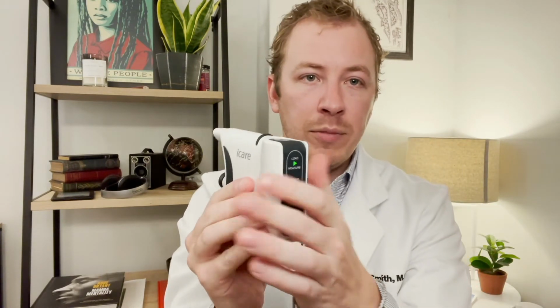If you're going to switch, make sure you take the wrist strap off and switch hands. And the hand position that was recommended to me was kind of wrapping your hand around and your finger on top, just so that it's pretty secure, rather than like this, which is just 2 fingers and can kind of slip. Once you get the hang of this, it's a little more secure. Okay, so we've switched, and you can use the same hand for both sides. I mean, that's not a problem. I've actually been doing that for the most part, but for the video, I like to cover the opposite eye because you kind of cross your eye.